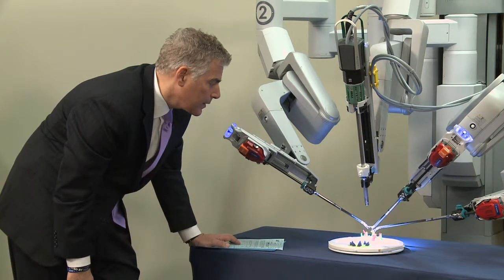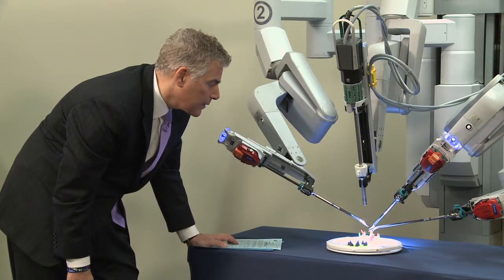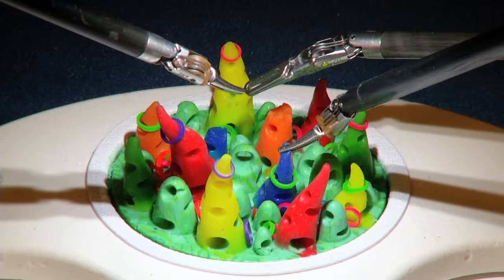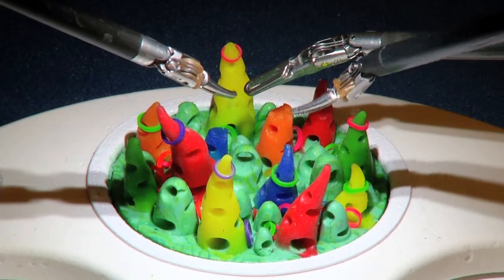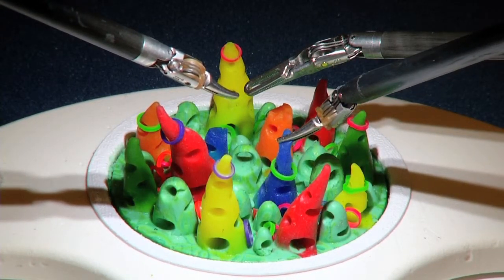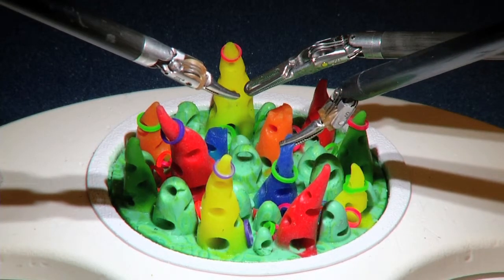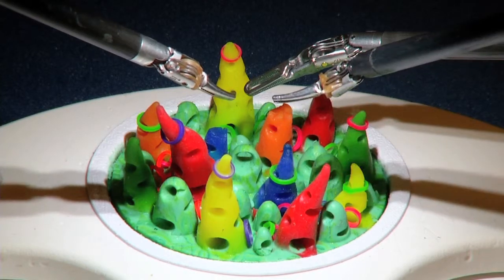Now, the one disadvantage is, and this is what you have to get used to as an operating surgeon, and we learned this during our training, is that you can't feel how strongly you're either touching something or how weakly you're touching something. So, for example, when I pull on this, I don't have any what we call haptic response in my right hand. I am pulling on this, but it feels the same whether I'm pulling way up here or whether I'm just pulling a little down here.